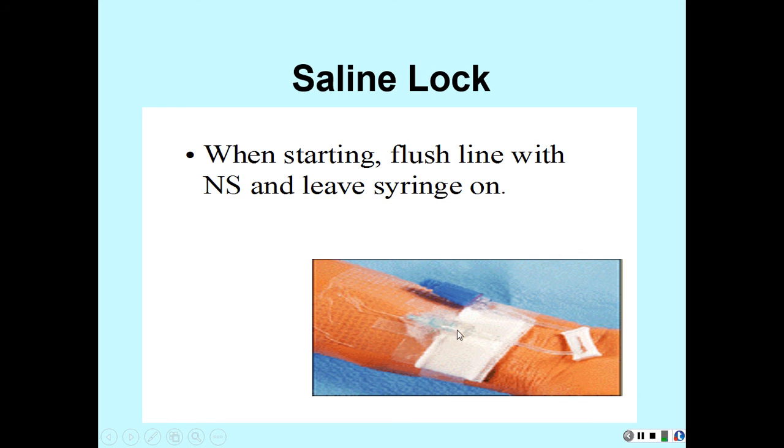All right. So you can take that right there. That's a clave, which is a type of needleless cap. You can take that and screw that onto your IV catheter and just have a saline lock. That's where you access the lock and all that. But it really works great, guys, if you can use an extension tubing here, an extension set. You just have a little more play with it.